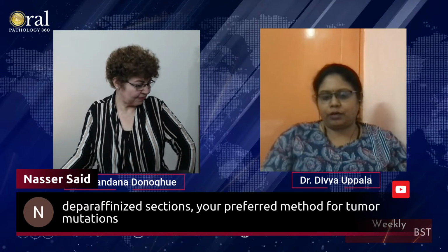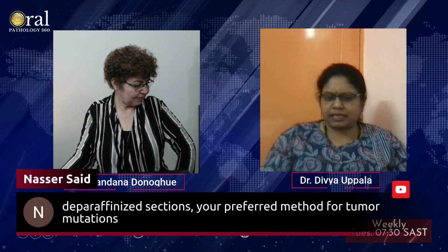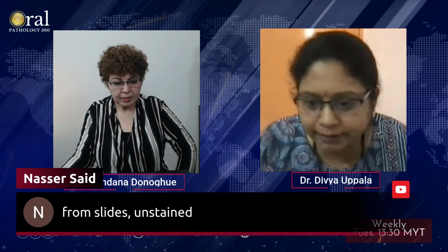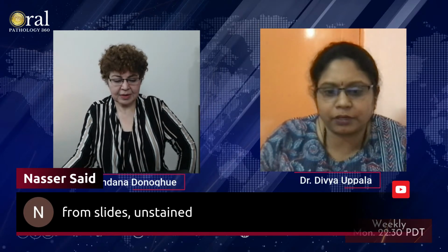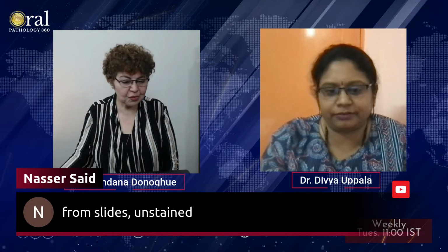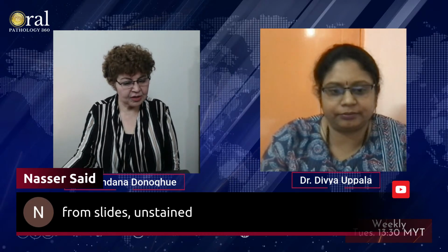For deparaffinized sections, we can go for microarray, and in situ hybridization is again on paraffinized sections. So there are many techniques. I can give you a detailed answer and I'll post it online, because there's so much of it. Replies are going to take more time than possible here, so you can all check it out in the YouTube comments.